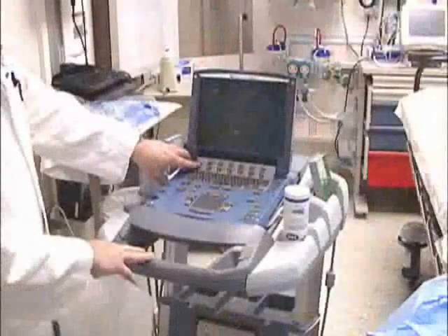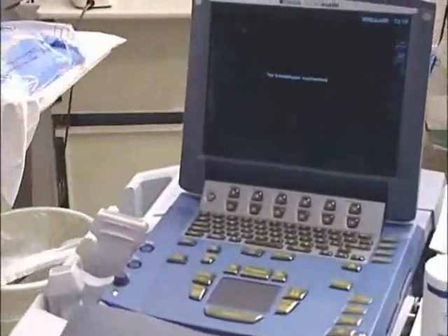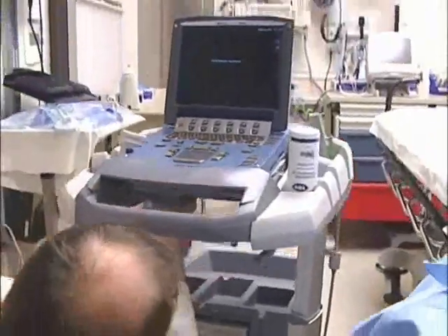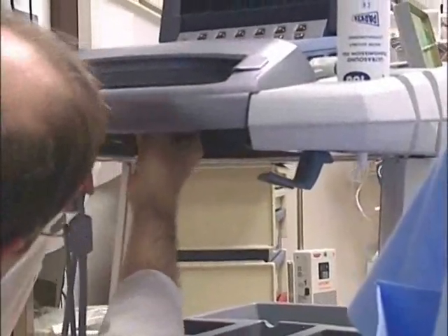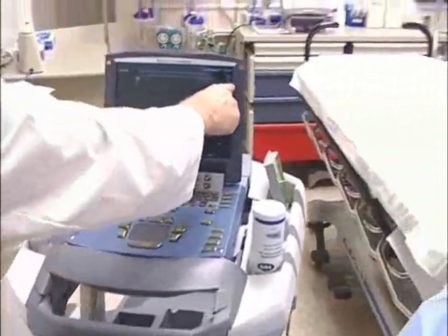To use the ultrasound machine, after the machine is plugged in, make sure that it is turned on. Connect the transducer at the bottom of the machine for the appropriate probe. For central line insertion, you'll be using the linear probe. Make sure that the machine is in the proper mode. It should show the vascular linear probe has been inserted.